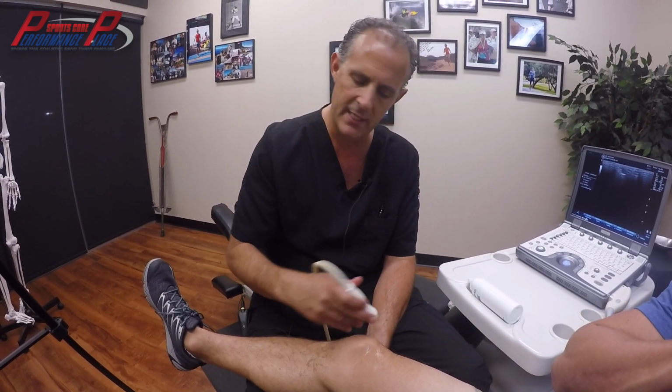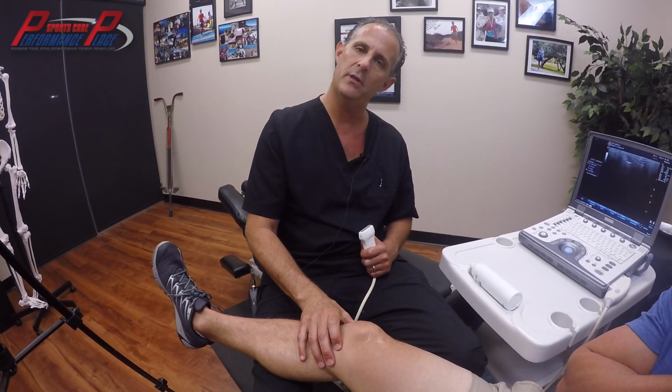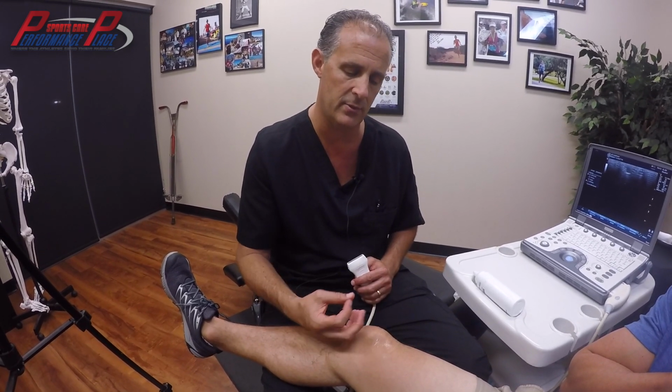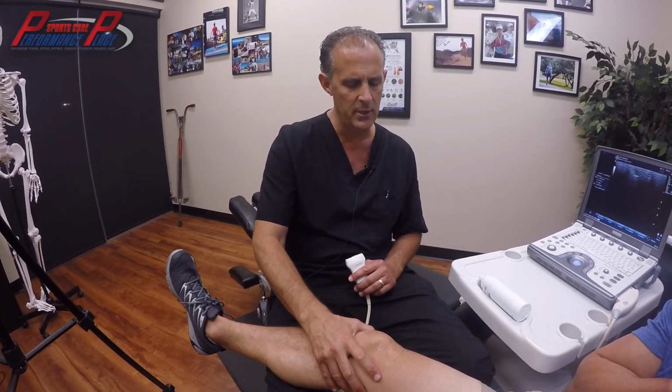From our experience looking at this knee, there are two things I'd want to see on an x-ray. Number one, I'd want to confirm this little spur on the outer part of the knee. In your case, you don't really have too many symptoms there, so we're not going to go too crazy. If you were the actual subject here that we were working with, probably we wouldn't need an x-ray because you're really not very symptomatic, and we feel pretty confident that there's a bone spur here. But if your pain really persisted along this outer part of the knee, then we might want to step up and get an x-ray to validate what we think we're seeing on the outer part.